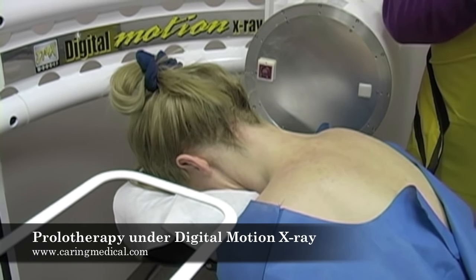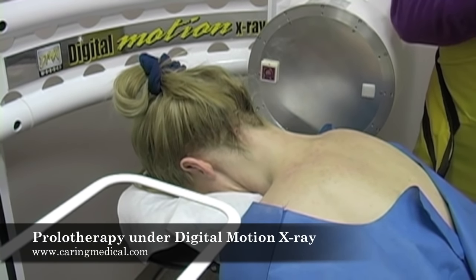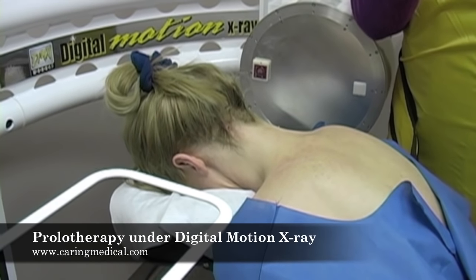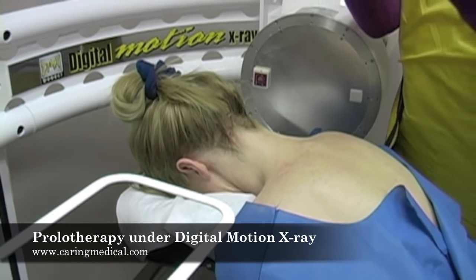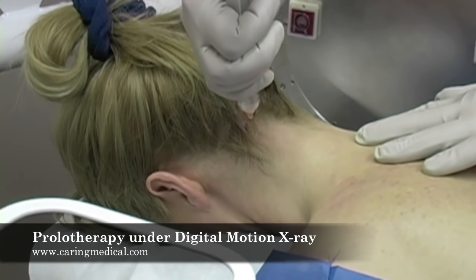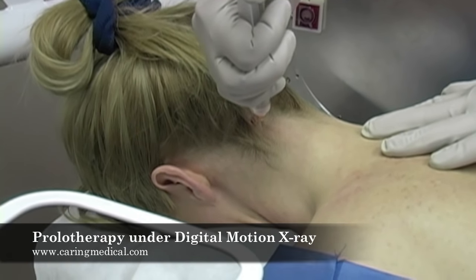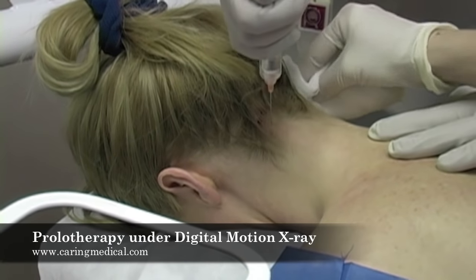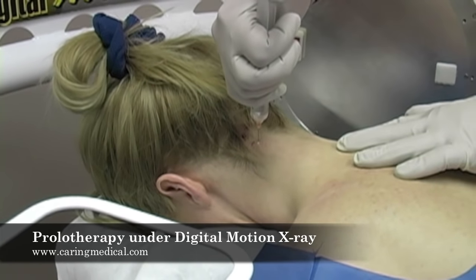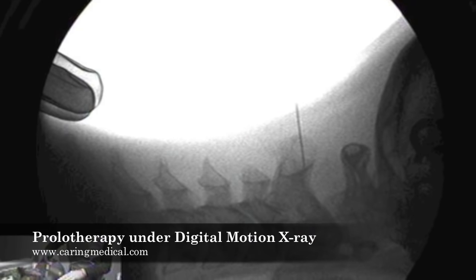There is no intervertebral disc between the occiput and C1, and there's not a disc between C1 and C2 either. That means a lot of the motion — especially the 'no' motion when you're nodding your head side to side — occurs between the C1 and C2 area. So anyone who's had a jolt of the neck can often be left with C1 and C2 instability.